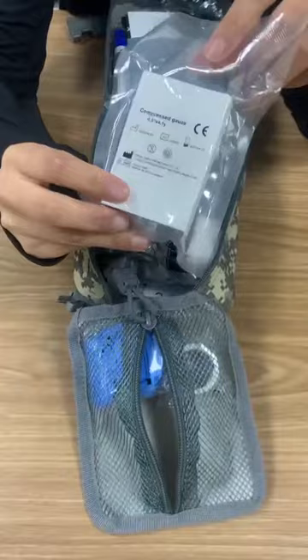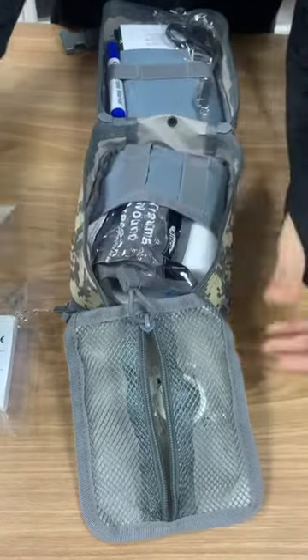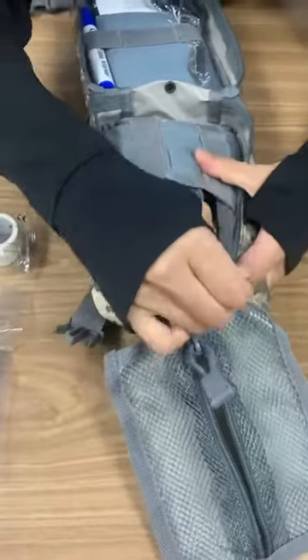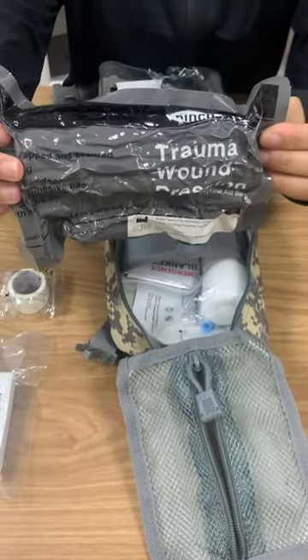And this is compressed gauze. And this is a pair of nitrile material gloves. And one non-woven tape. And a six-inch elastic bandage.